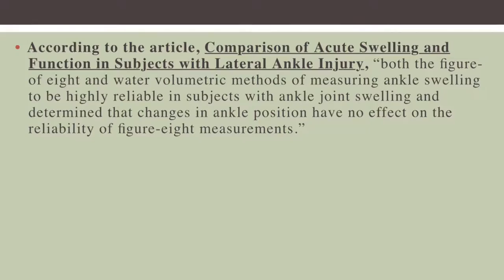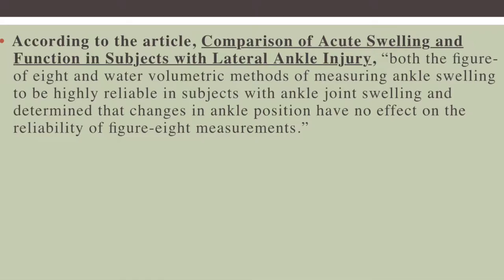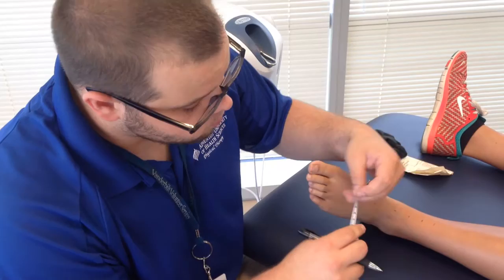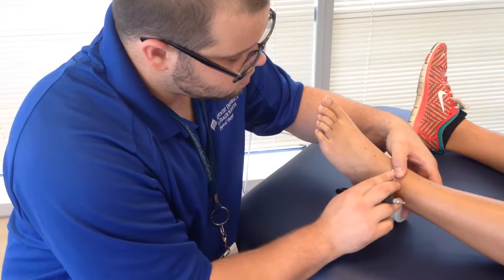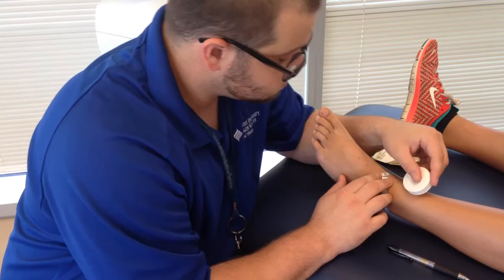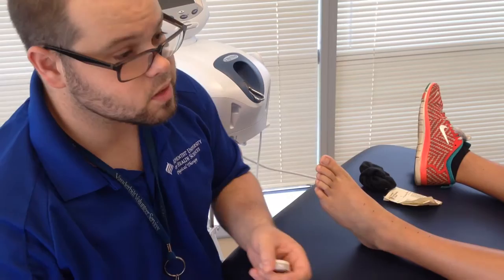For this demonstration, I will be performing a figure eight. According to this article, a figure eight is a very highly reliable measurement for determining ankle joint swelling. They're pretty consistent with their reliability. We're just going to put mid-malleolus, wrap around, go underneath the foot, and come back up. So, 46 — she's 46 centimeters. It's always important, once we do the involved leg, we want to check the uninvolved to see if there's any differences in measurement, and then we can tell if she has atrophy or swelling.